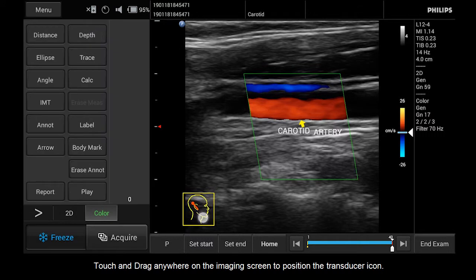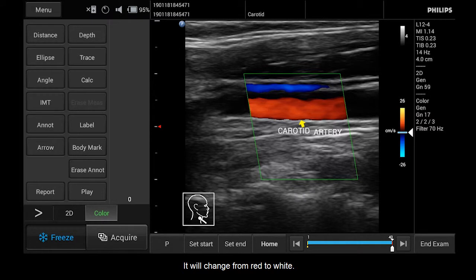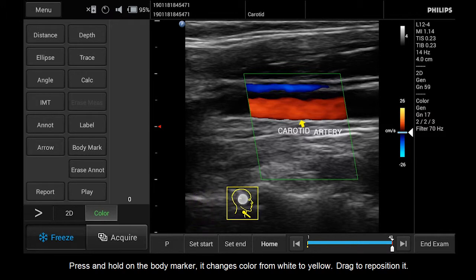Touch and drag anywhere on the imaging screen to position the transducer icon. Touch and drag in a circular motion on the imaging area to rotate the transducer icon. It will change from red to white. Press and hold on the body marker — it changes color from white to yellow — then drag to reposition it.